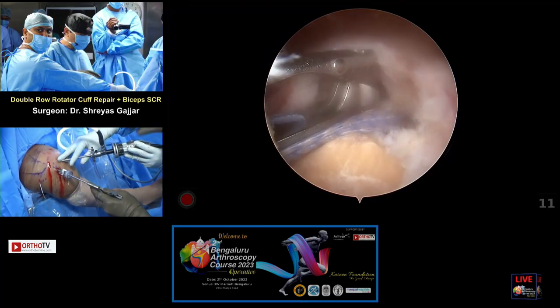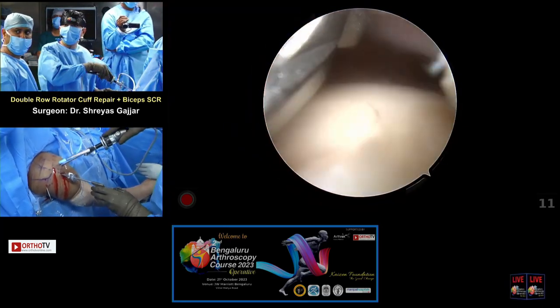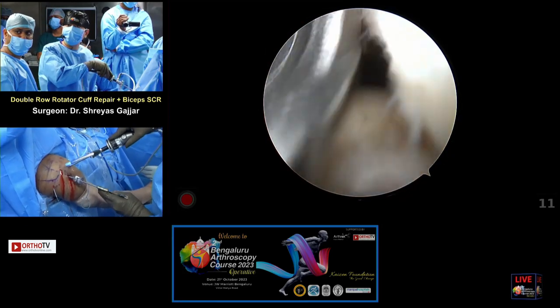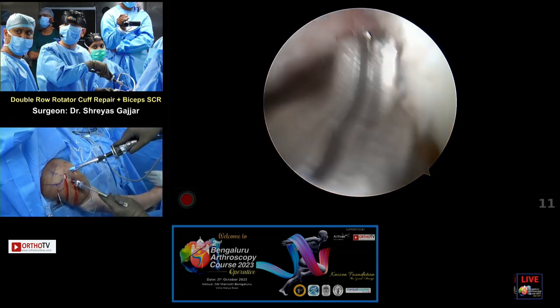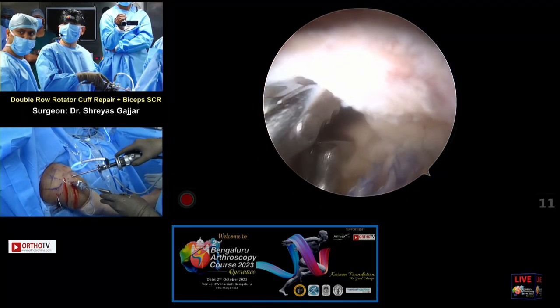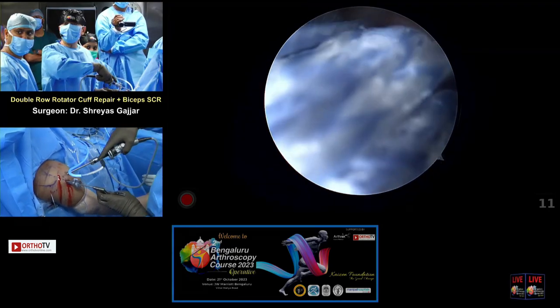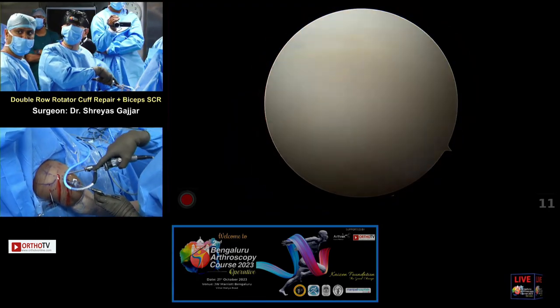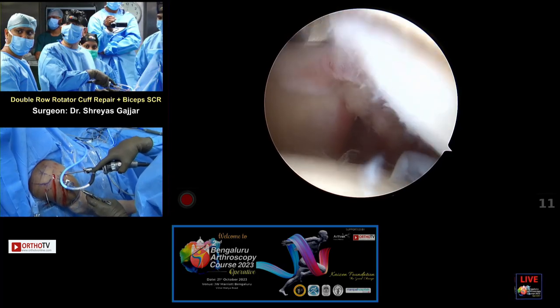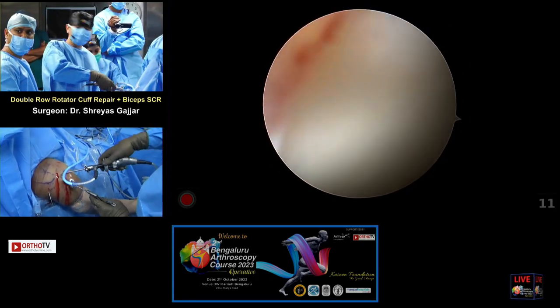So here I need to make sure that the biceps is not caught up. You can see the biceps underneath here, so I'll have to go above it. First I'll just pass the instrument and then have a look. Sometimes the area may be small, so you may not be able to see, but the biceps is here, so I'm just going to go above it. I'm just going to check it again.